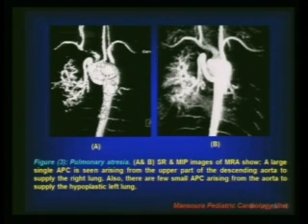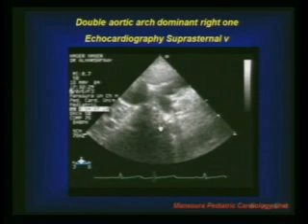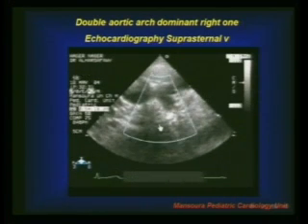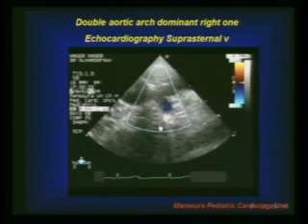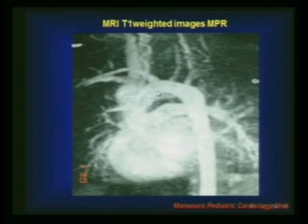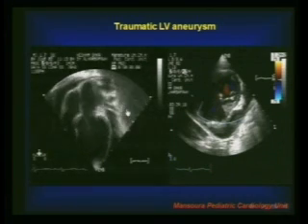Here is a patient with pulmonary atresia in which MR clearly shows absent pulmonary artery and large major aortopulmonary collaterals supplying the lungs. This is a patient diagnosed by echocardiography with a double aortic arch — the two arches are visible — and MR was used for confirmation before sending the patient to surgery. This is a nice example of how MR beautifully demonstrates the anatomy.